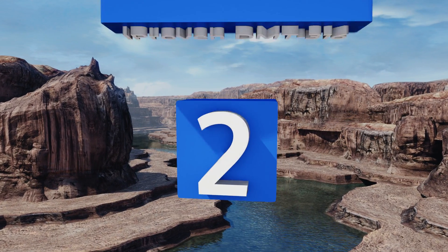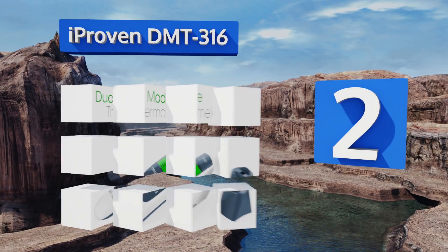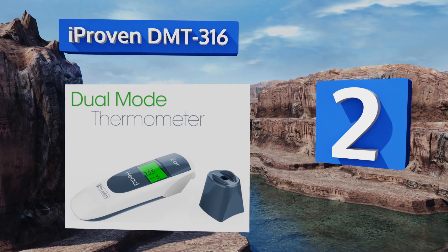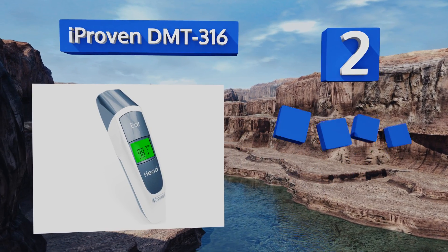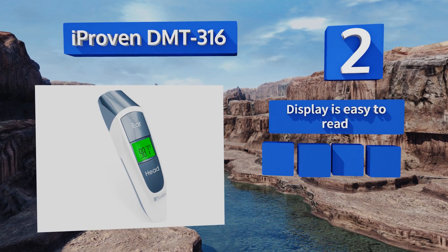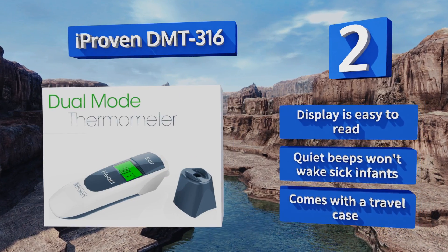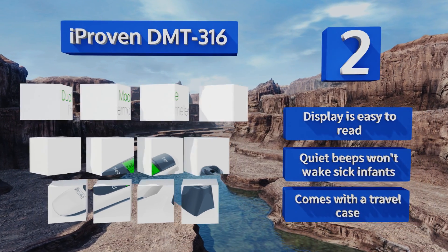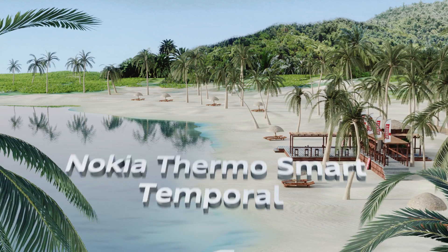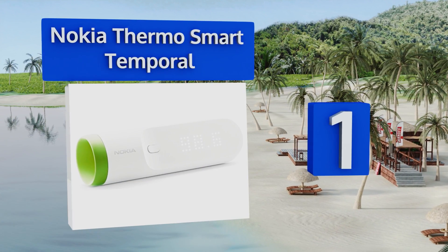At number two, the iProven DMT316 is a foolproof instrument designed for both ear and forehead use. The color indicator distinguishes between levels of severity: a serious fever will light the screen red, a higher than average one orange, and a healthy level green. Its display is easy to read and its quiet beeps won't wake sick infants. It comes with a travel case.